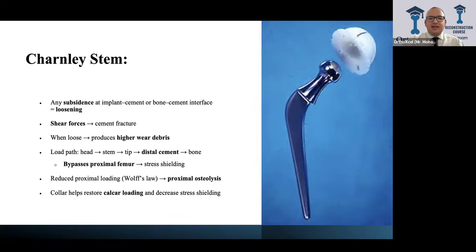So his idea for the head was to achieve a low friction arthroplasty. A small head moving inside this cup means less friction, and less friction between the two surfaces means less shear force across the bone-cement interface on the cup side, and this means the cup will live longer without any failures.